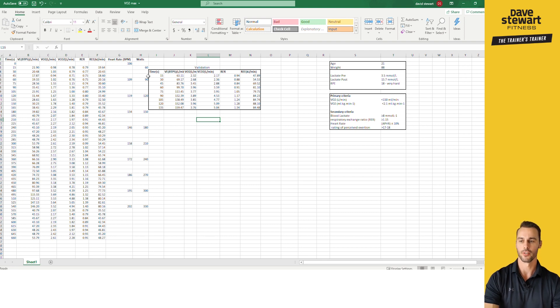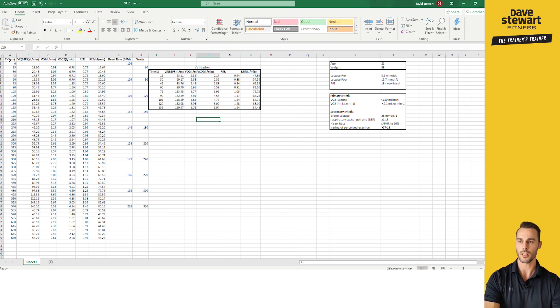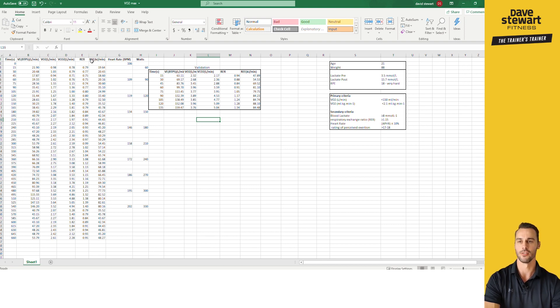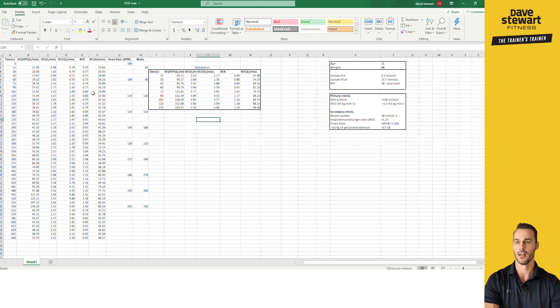So if you have a look at the data printout here, we got time, ventilation in liters per minute, volume of oxygen liters per minute, CO2 liters per minute, RER, and then we got the energy exchange, heart rate, and watts. We're not going to worry about energy yet, so we'll just focus on these guys over here.